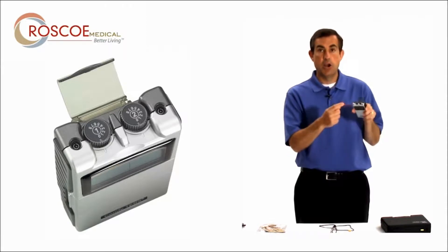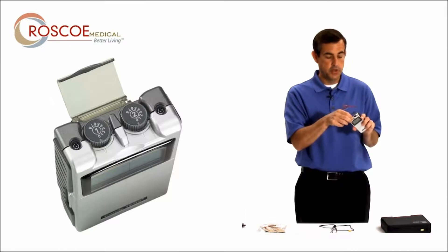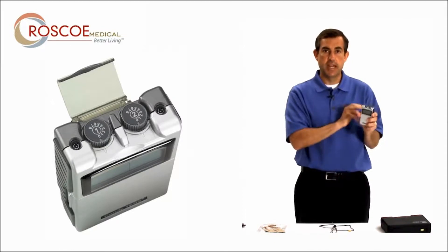The knobs on top are how you turn the unit on and off, so you want to make sure they are both in the off position before you start setting up.